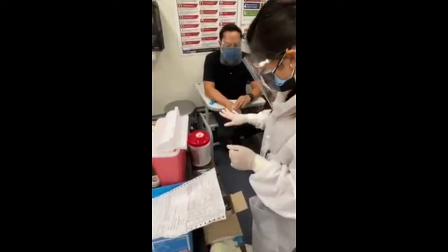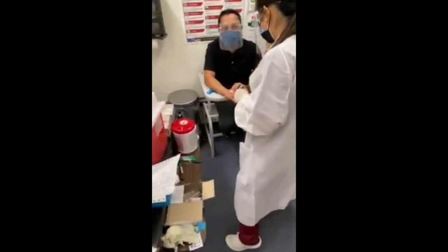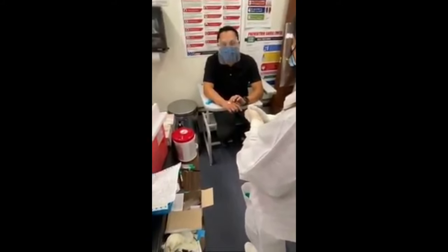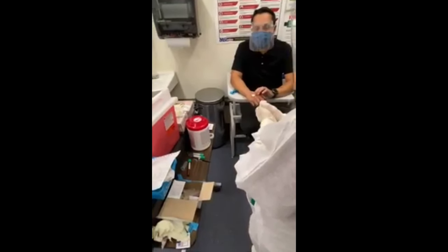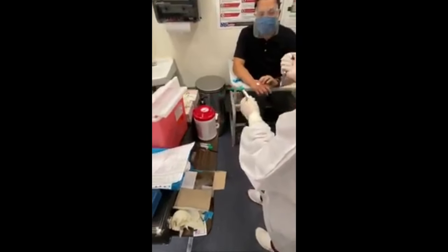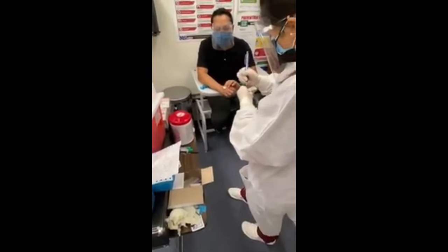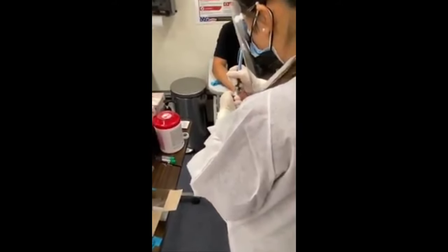I'm applying pressure. Before you bandage the patient, because if you bandage me now, I'm going to leave, you have to do something before I leave. What do you have to do in the room before you leave? Oh, yeah. Let me just label your tube. So you would put the sticker on, and then once the sticker's on, you would put the date and time, and your initials. Okay, go ahead and do that. Perfect.